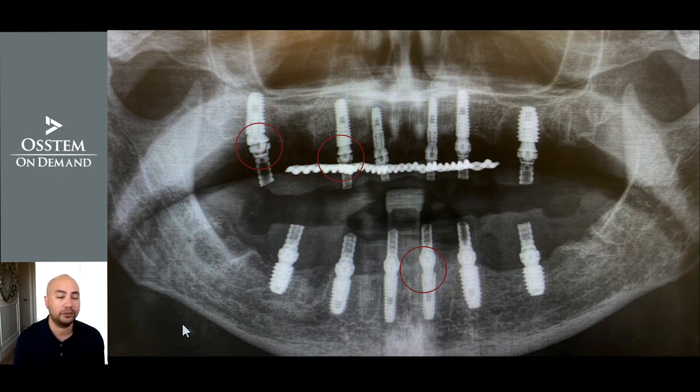So what we have to do is to remove the prosthesis, adjust the pressure and then reduce the fitting surface. And when we have a misfit of the multi-unit abutments, if the implant and the multi-unit are stable, that can be either addressed on the day of surgery, or if we are tired, we can do that just before taking the final impression.